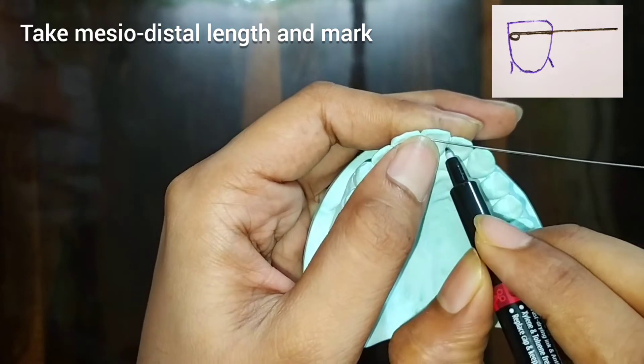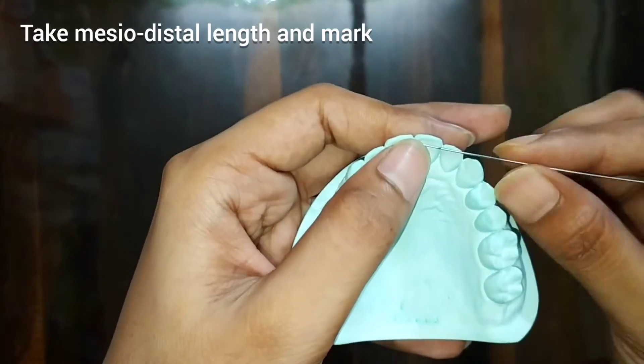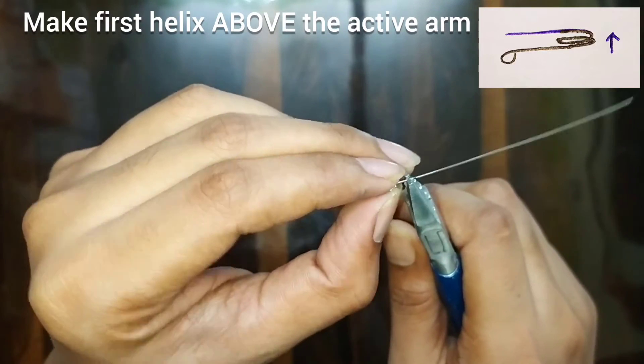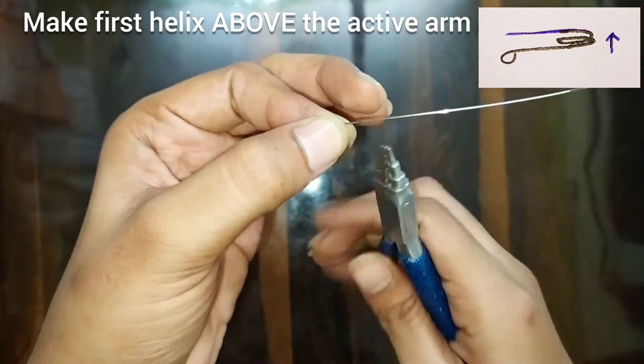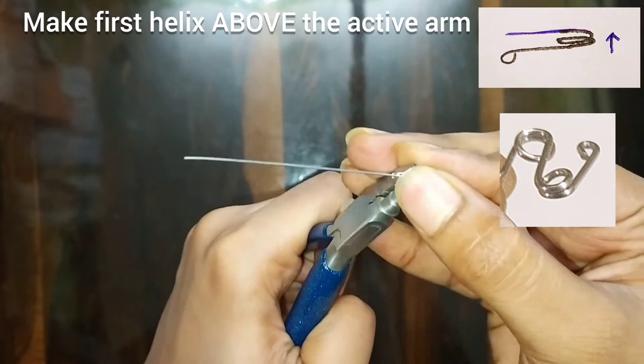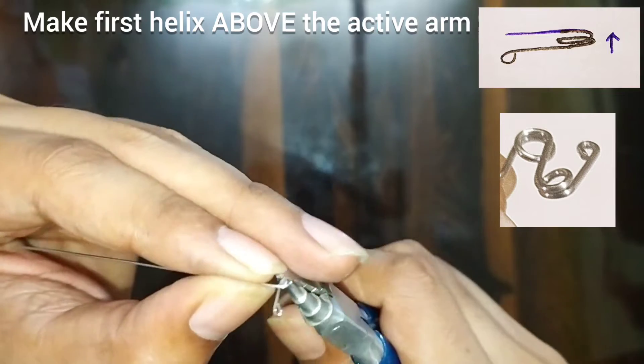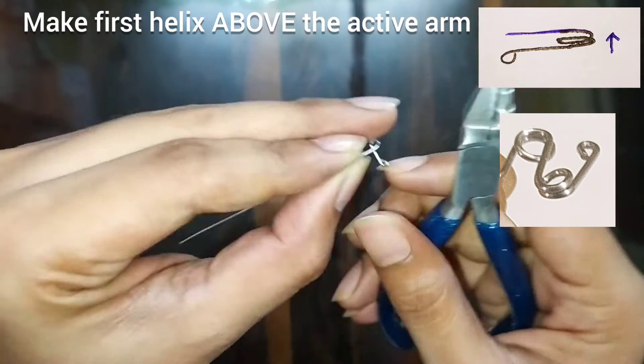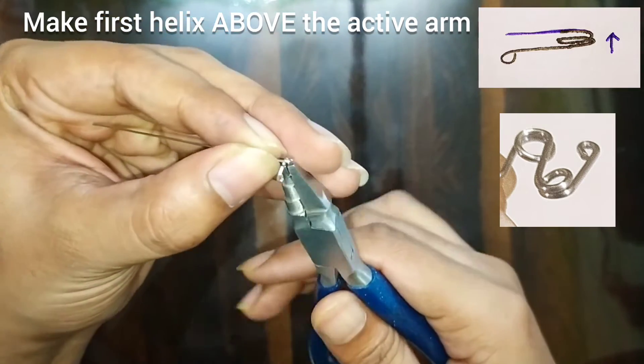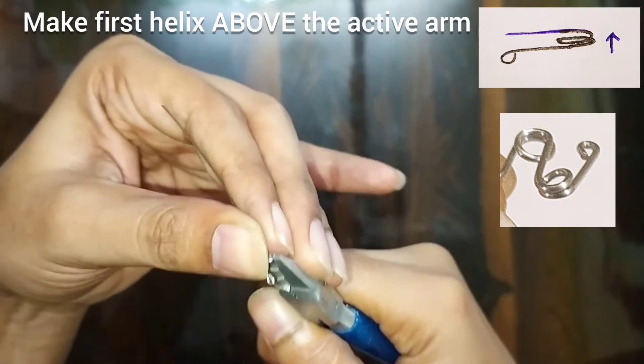Here we will do the marking for the helix. It should not exceed beyond the dimensions of the tooth. Hold the wire tightly at the tip of the Adam's plier. Here we are making the helix. The helix should be above the active arm. You can see here in the figure. Just give one complete turn and bring the wire parallel to the active arm.